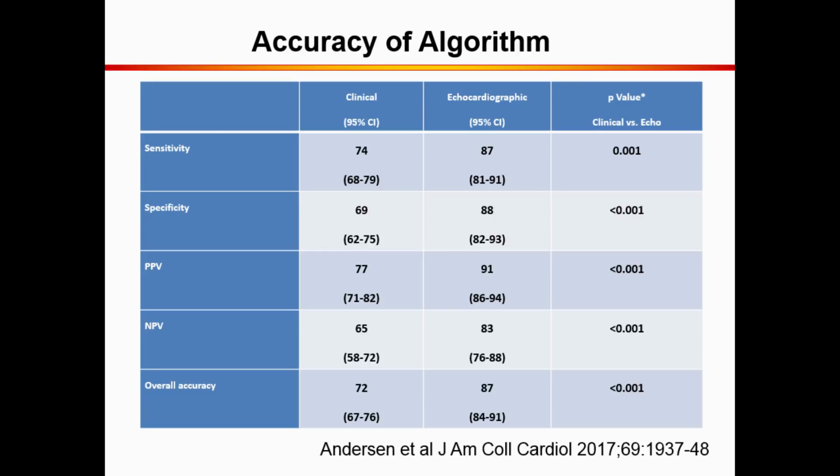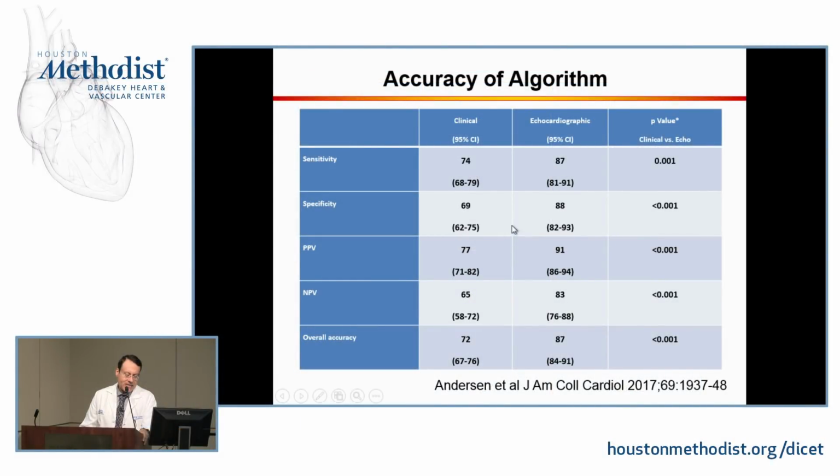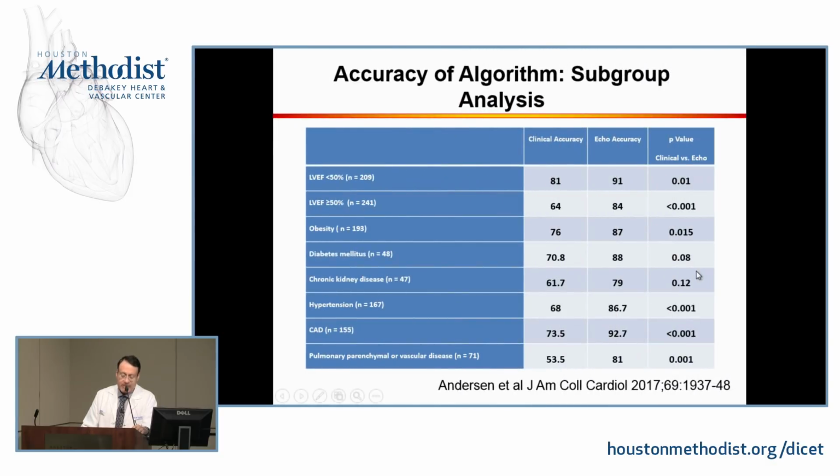We looked together with other sites in Europe, Canada, and South Korea at the accuracy of this approach in 450 patients, and we compared clinical assessment. Clinical assessment included a look at the clinical exam data, the chest X-ray, and when available, the serum biomarkers. And we noticed that echocardiography was more sensitive, more specific than clinical assessment. These were done by cardiologists, so I would say probably a better case scenario than if you take all physicians looking at patients. Decent positive and negative predictive values and accuracies, and all of these were highly different, statistically significant, that is.